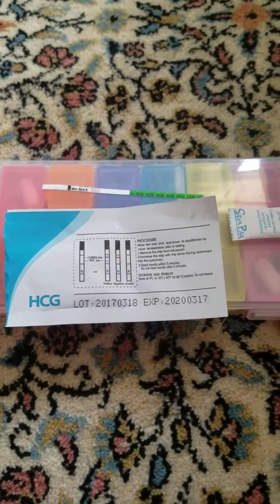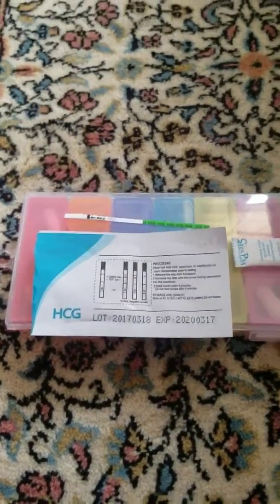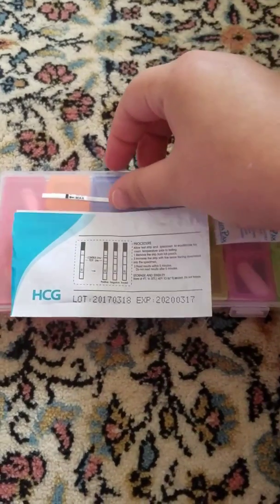So this is how it comes. Those are my pills on the back, but it comes with one strip, and it also comes with this little desiccant packet just to keep it dry.